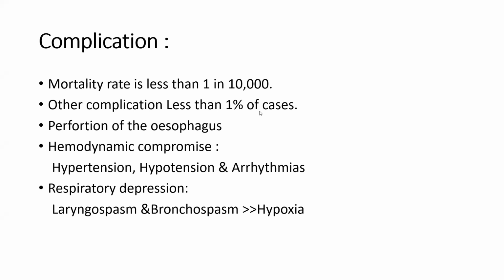Fortunately, the TEE, as I told you, is one of the safest procedures. In the last 5 or 6 years, we are working as consultants in the Cardiac Center, we never confronted any mortality case. The mortality rate is very low, 1 in 10,000, and the other complications can all be treated.